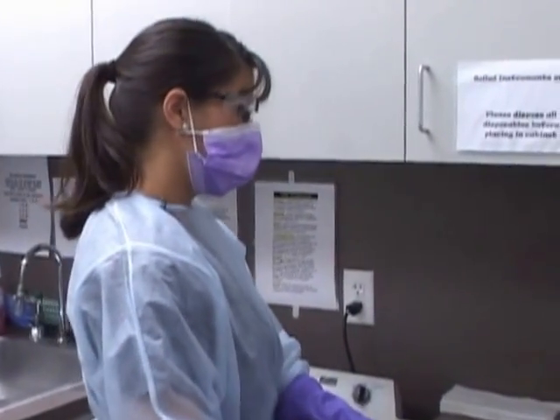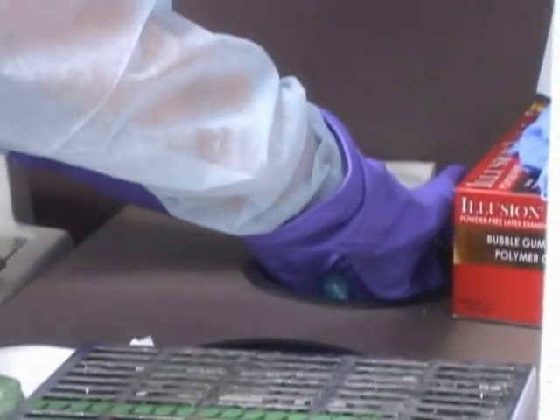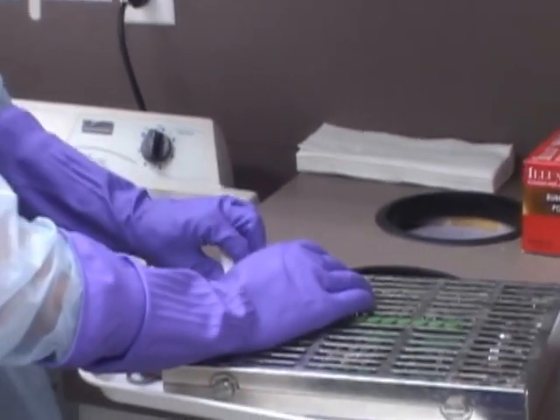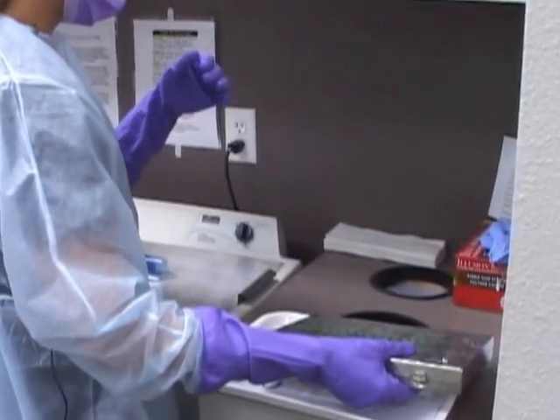Our contaminated trays are broken down. Sharps are disposed of carefully into a hazardous sharps container. All soil disposals are disposed of in hazardous waste. Our instrument cassettes go through steps to proper sterilization.